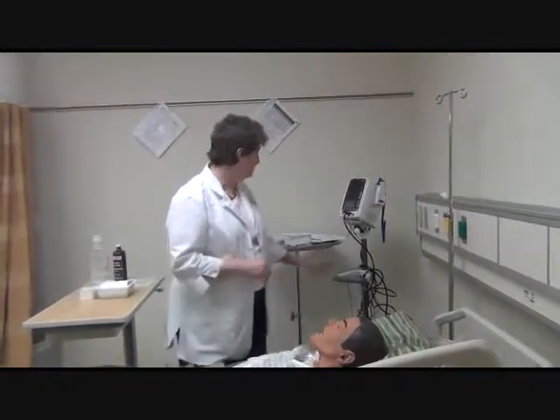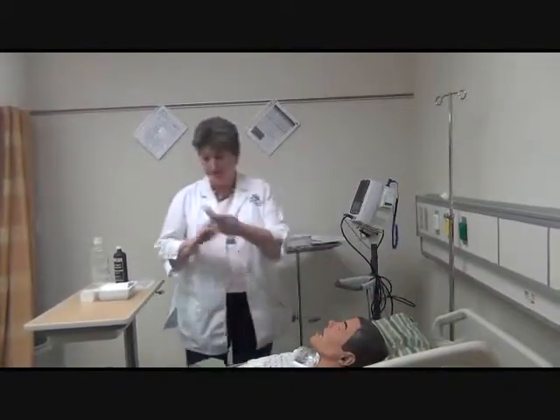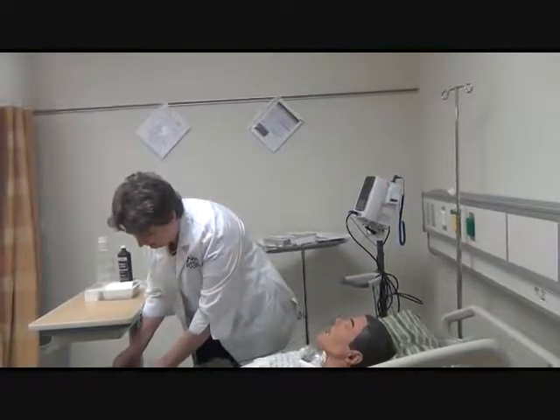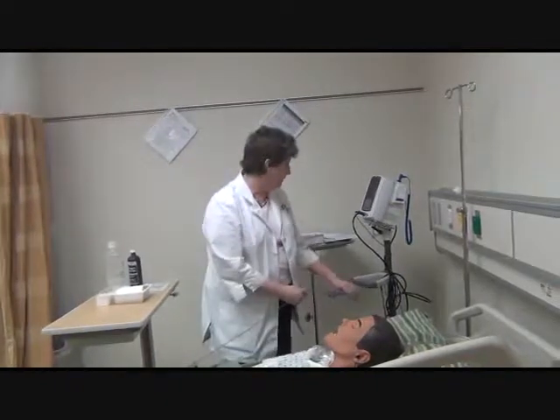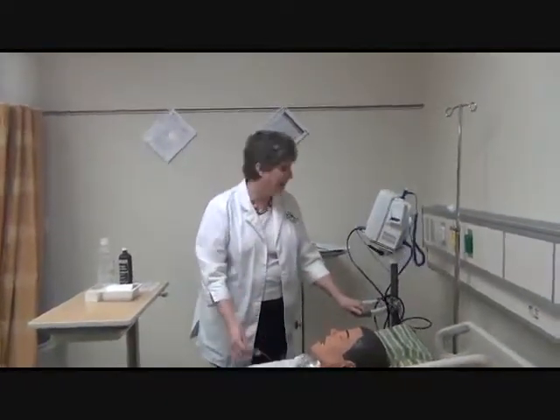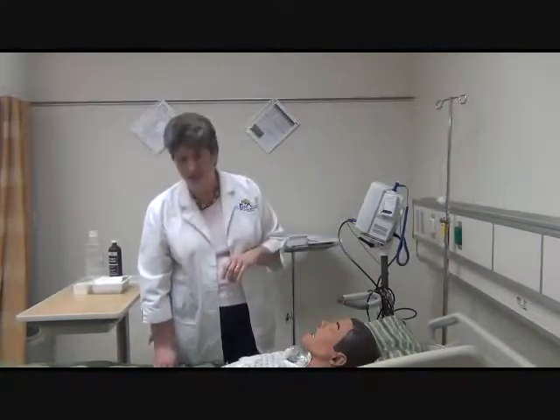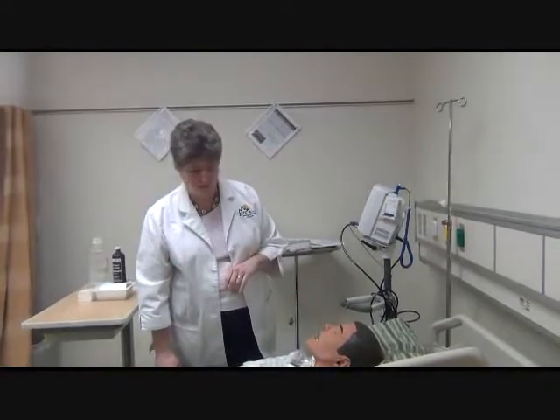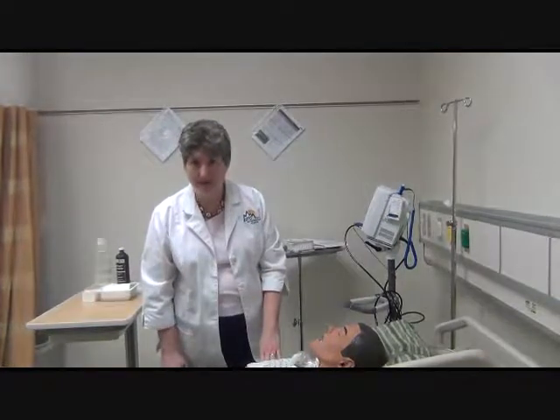We're going to put a pulse oximeter on our patient and do a complete set of vital signs. You don't have to do temperature necessarily, but if it's time for their vitals, you might as well just get them all. So we're going to do a pulse oximeter at the same time and watch the patient's oxygen status. I'm also going to get their pulse. Blood pressure, depending on the status of your patient.